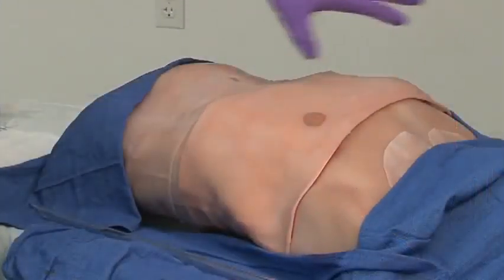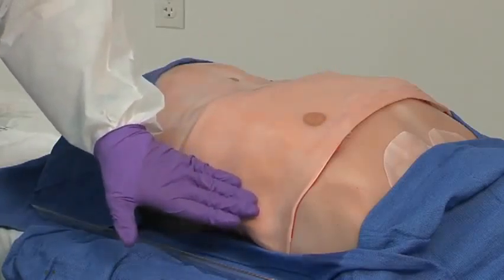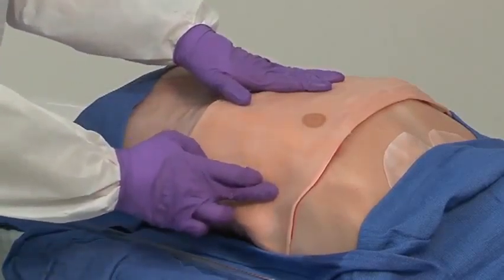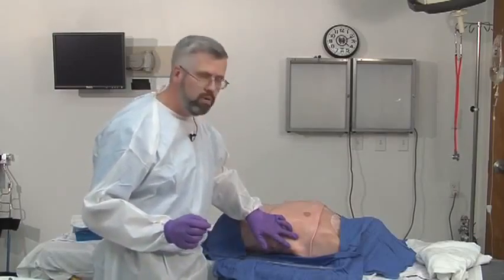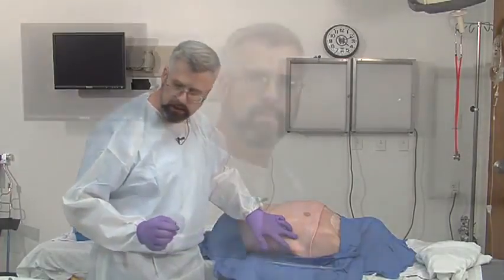Obviously, you want to make sure that you prep this area widely. You're going to once again reaffirm your anatomical landmarks, which are going to be the fourth or fifth intercostal space, approximately right here. If this patient is somewhat aware, it's good to put in some local anesthesia, but we'll assume that this patient is comatose and doesn't need it at this time.